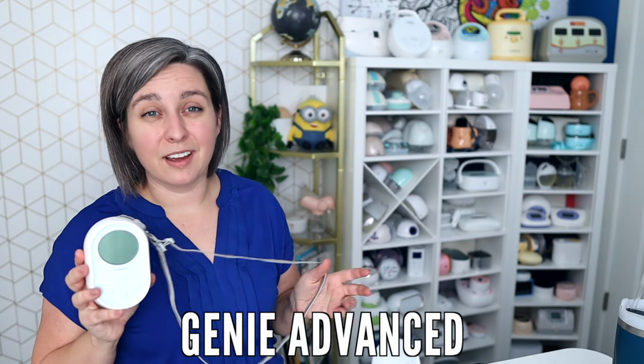Ooh, I thought of one more. One of my favorite little portable pumps is the Genie Advanced. If you've been on this channel before, that is not a secret. One of the reasons, though, is because you do have some cycle speed flexibility in expression mode. They've got speed 1, 2, and 3. It's kind of like slow, faster, fastest, just to give you some options to choose. I find that Spectra users who end up using this pump tend to like to pump on cycle mode 3. A little bit faster.